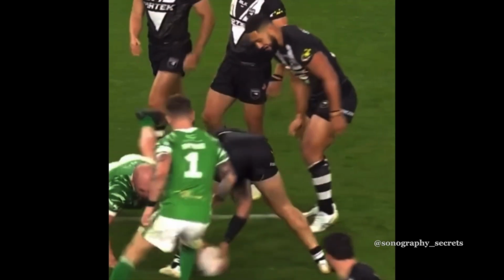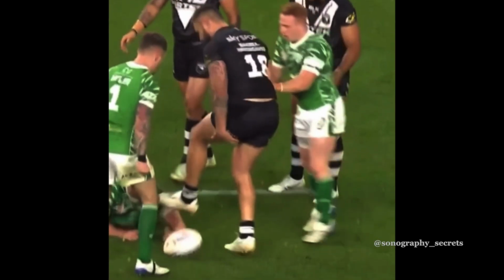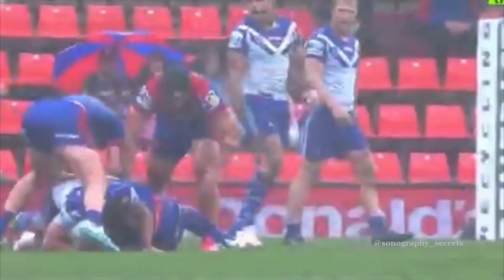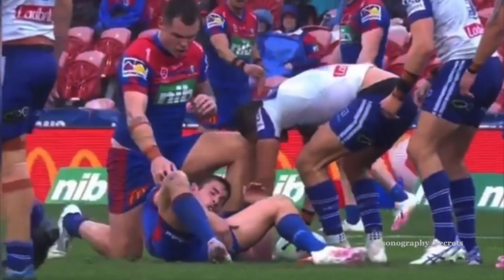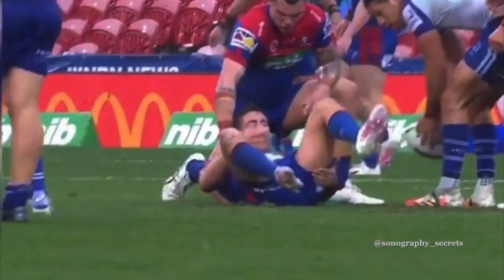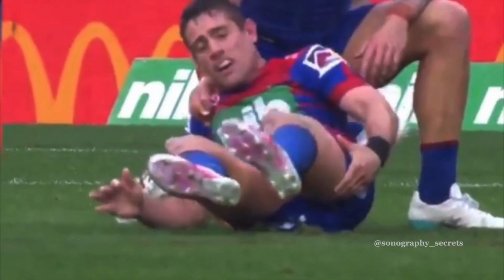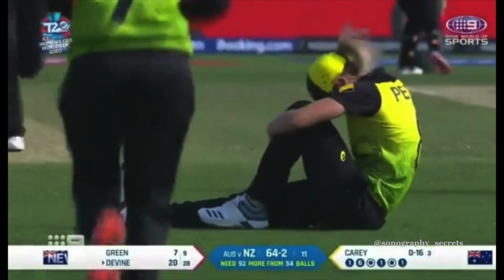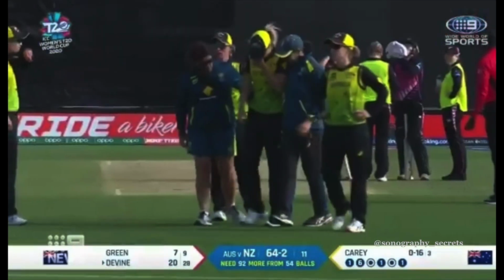You need a methodical, a systematic, and pragmatic approach to these ultrasound examinations. If we scan these like we scan a breast or like we mow the lawn, we've got no hope. We might get lucky and see the hematoma, but we'll have no hope in being able to identify what part of that muscle tendon unit has been affected. And that is our primary objective.